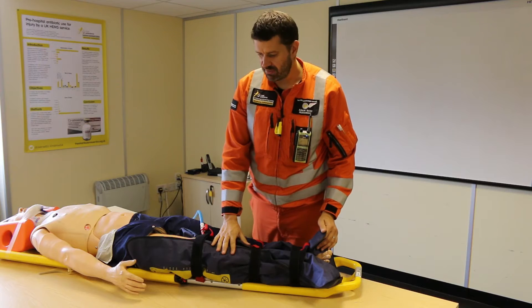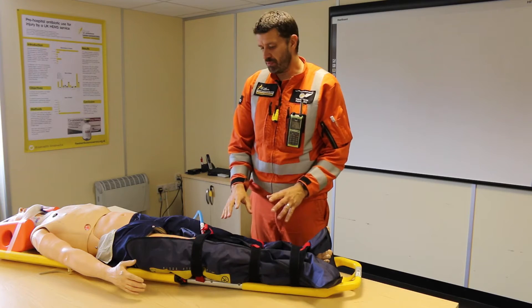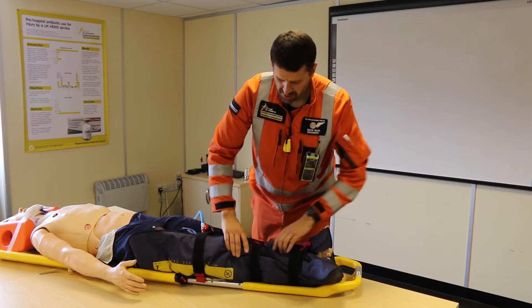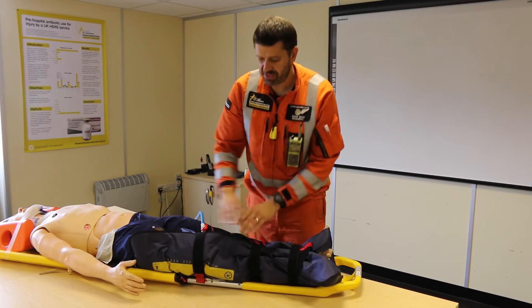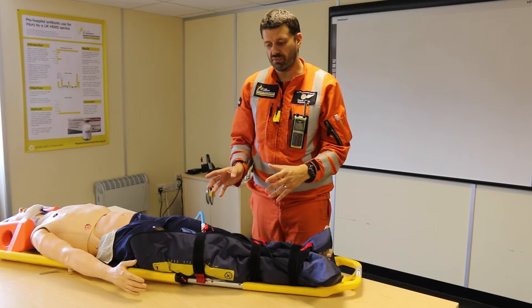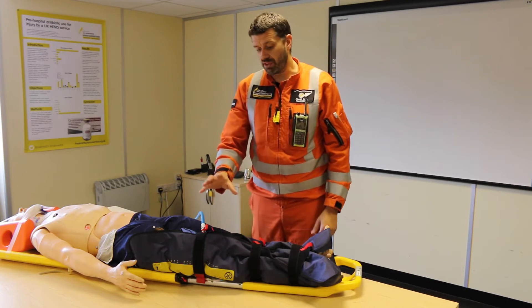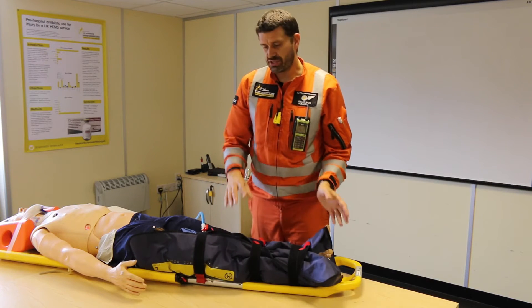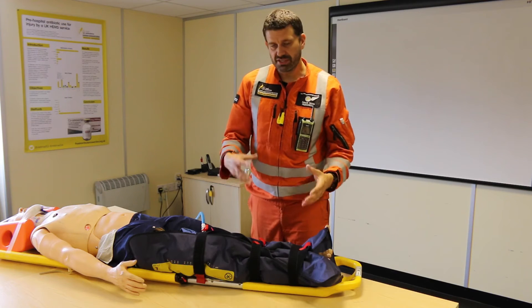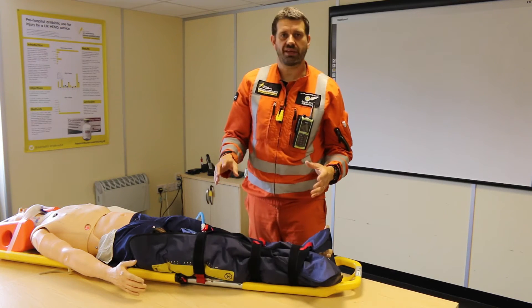This is a vacuum splint. It's called a vacuum splint because the way it works is by moulding the splint around — as you can see, it's quite soft at the minute. By moulding this splint around a fractured limb, we can provide a really good level of immobilisation and splinting itself. And one of the benefits of this type of splint, as opposed to something like a more rigid box splint, is it does give you that ability to mould it around those complex and complicated fractures.